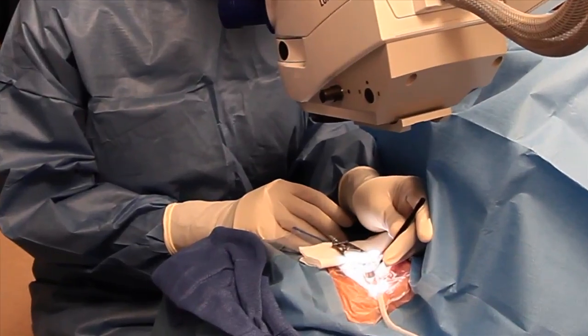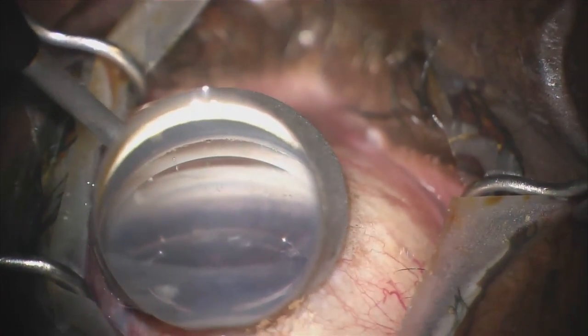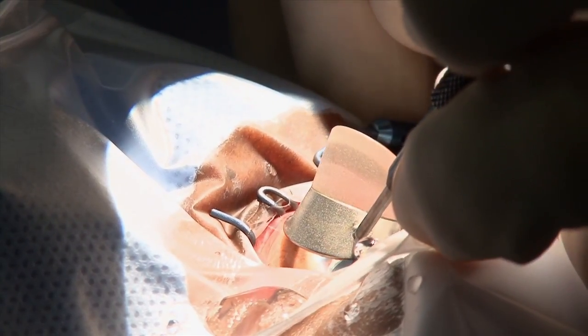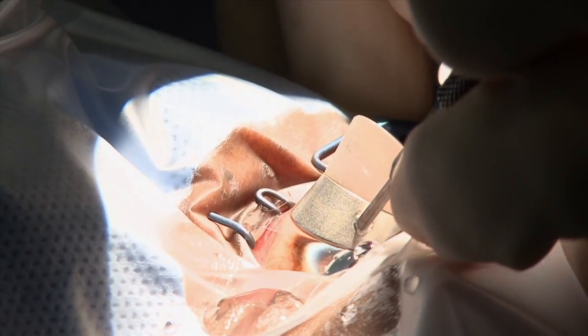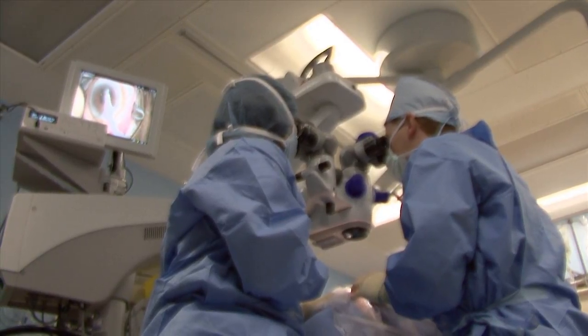Before you even start doing your first procedure, I would advocate practicing going through the motions. Hold the goniolens on the cornea without indenting the cornea. It'll help getting used to using two hands so that you're holding the goniolens with one hand and inserting an instrument across the anterior chamber into the opposite angle with the other, and making sure that you're able to keep your view. If you can eliminate some of those factors, it will significantly reduce your stress the day that you're actually doing the surgery. Paying attention to details is always the name of the game in our field.